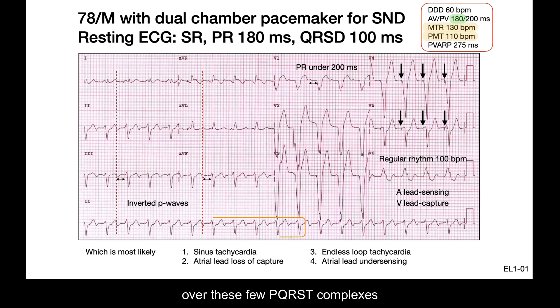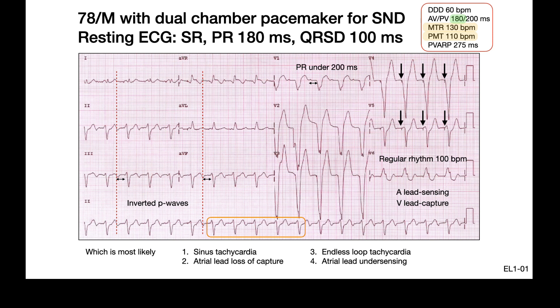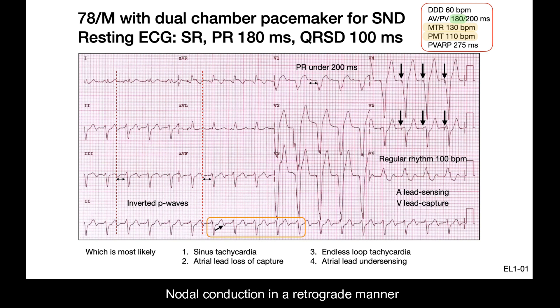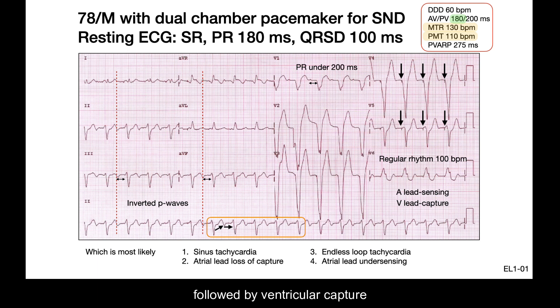Focusing on the rhythm strip over these few PQRST complexes: it starts with ventricular capture, followed by an inverted P wave suggesting nodal conduction in a retrograde manner. This is followed by a PR of under 200 milliseconds, corresponding to the programmed parameters, and then ventricular capture again.